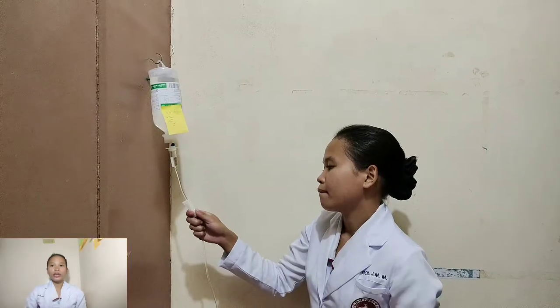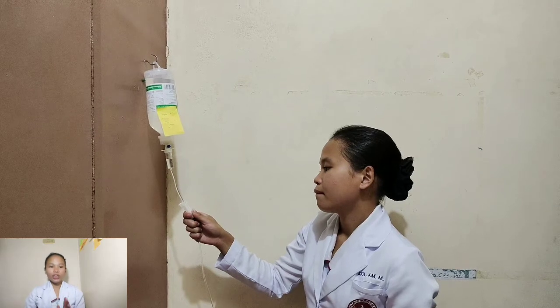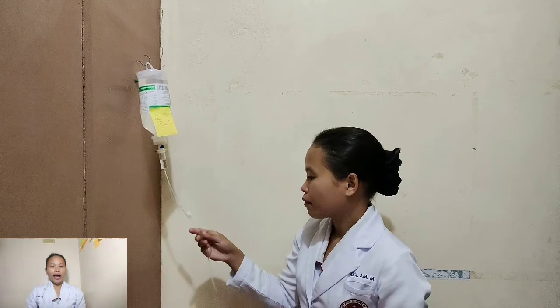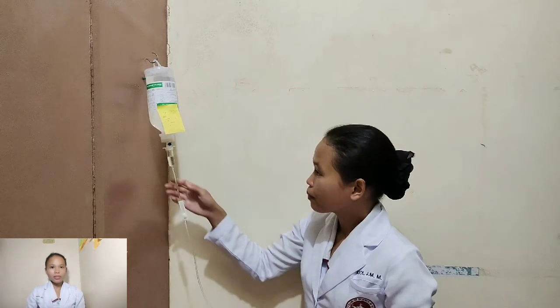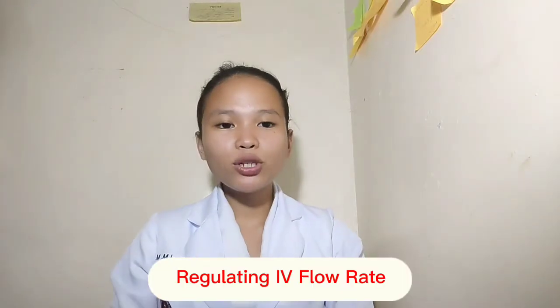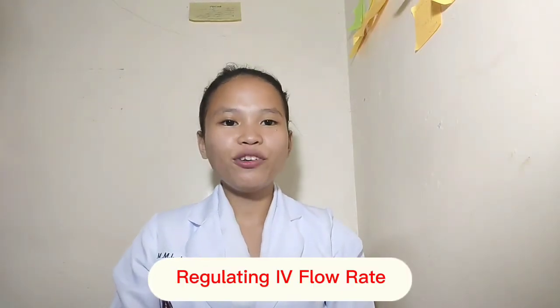And lastly, monitor periodically, at least every 30 minutes, to check the flow rate and observe for infiltration and other untoward symptoms. This documents the client's response to the infusion. Next, the second procedure is regulating the IV flow rate.